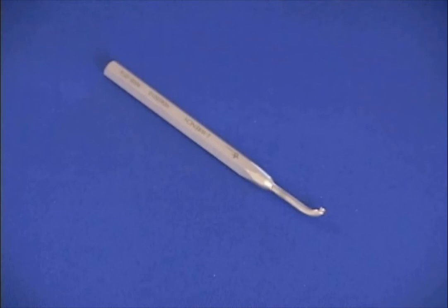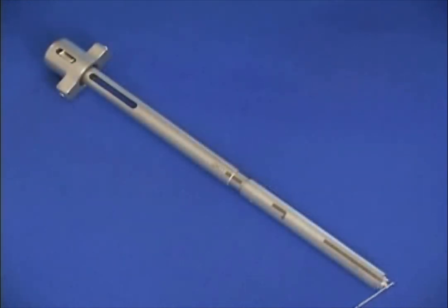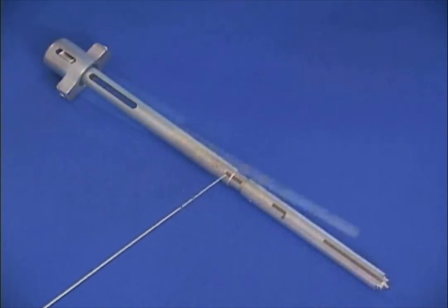The L-wrench is utilized for rod manipulation by inserting the distal hex of the instrument into the recessed hex of the rod. The cap inserter is utilized during initial locking. Reference marks at the distal end of the instrument aid in alignment during both cap loading from the tray and cap insertion into the screw head. A visual indicator at the middle of the instrument confirms when the cap is properly loaded.